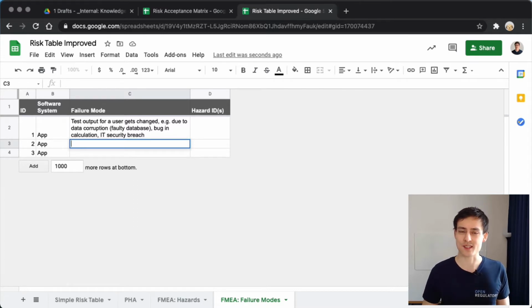Clubhouse had this interesting situation where you can essentially look up their public APIs and just download all user profiles. And then they say, yeah, this is public information, but I don't know. You could argue for a long time about that. Applying that to our software, we could have a bad IT security or authentication setting, which allows other people just to download all data, even though maybe it's personal and private data.